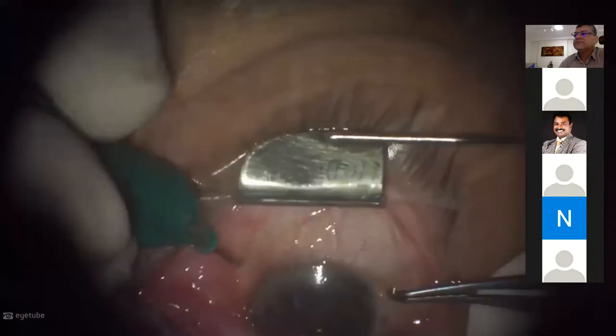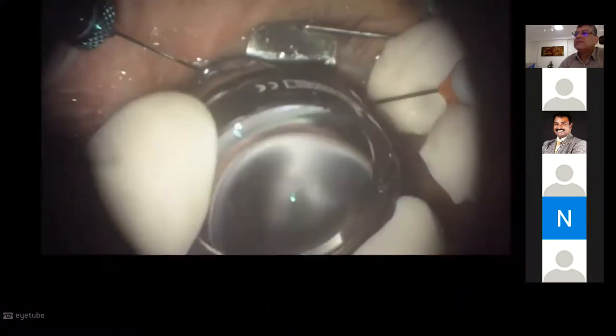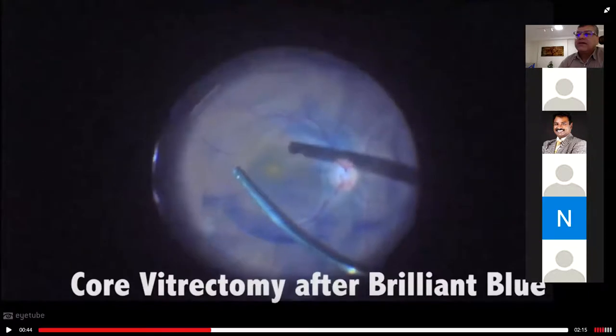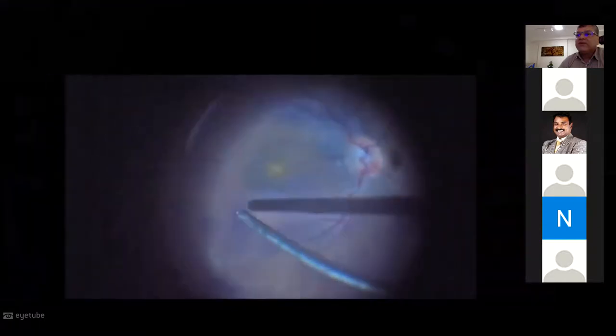Start with inverted 23-gauge vitrectomy using a wide-angle contact lens. We already did core and peripheral vitrectomy and used brilliant blue. We already did the air-fluid exchange and have a very good view of the macular area — everything is bluish and you see the internal limiting membrane there. So how can I go over the internal limiting membrane without damaging the retina? You want to be very, very careful.